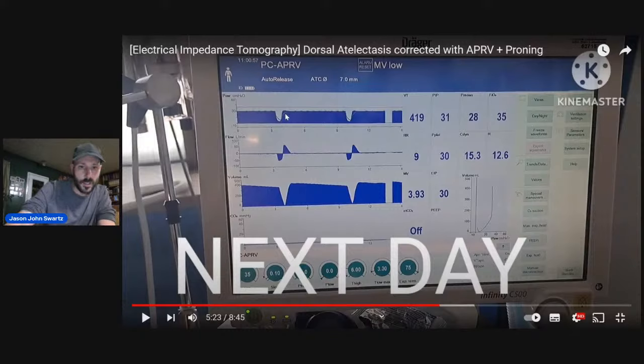So if you add a slope, then during the release the lungs are deflating, and because the pressure is not popping up as fast, it's a little slower, it drops a little bit lower. If volume's an issue, you can play with your slope a little bit, and start playing with your 75%, though I don't suggest that. Once your volumes are adequate, you end up weaning this down to 0.0. That's the way I use it.